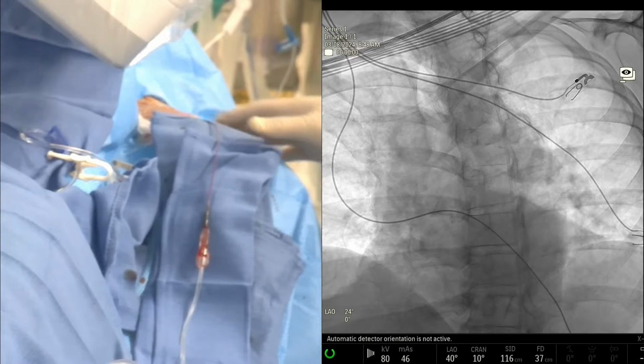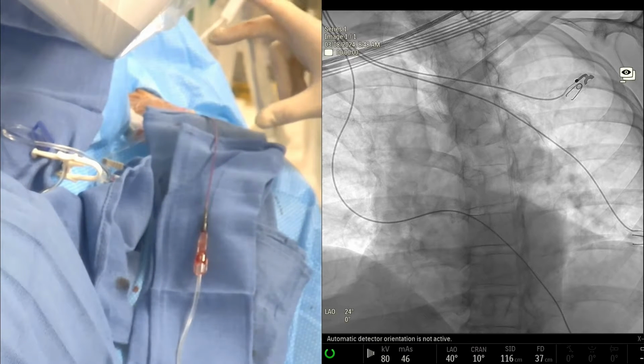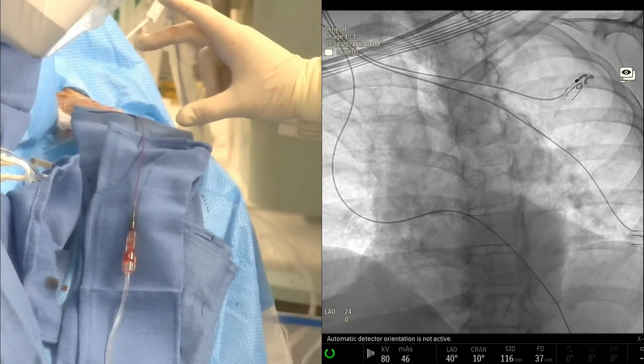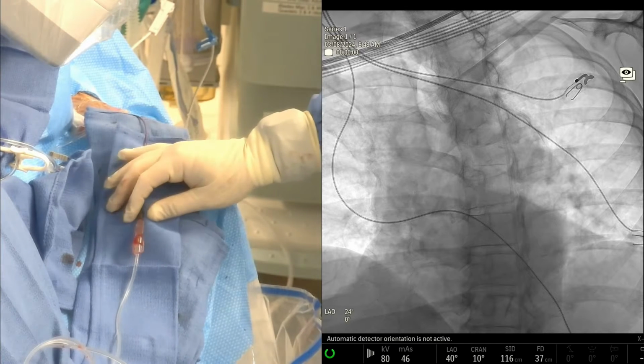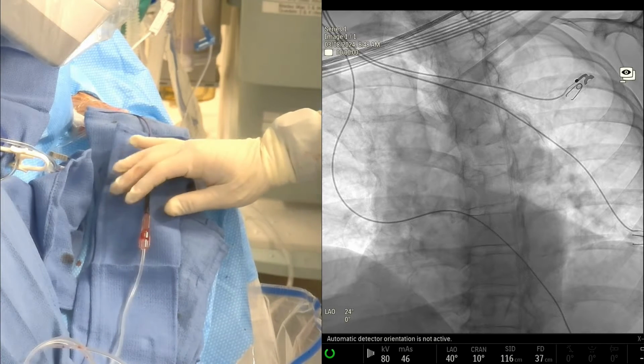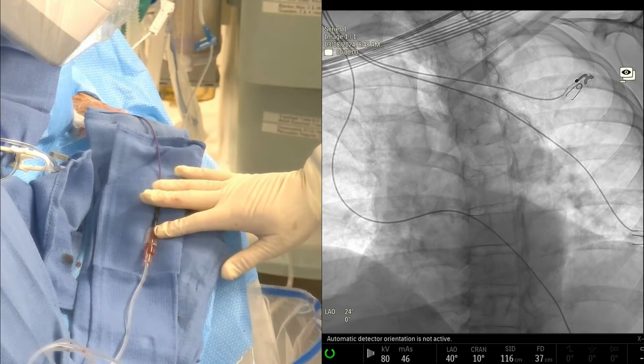We usually access a little bit higher on the wrist, approximately about that much higher than the styloid process, which gives us ample space to get our diagnostic catheter pretty close to the prostate artery. As you'll see in a few minutes, that's one of the key things, in my view, to getting very close and getting a quick cannulation of the prostate artery.